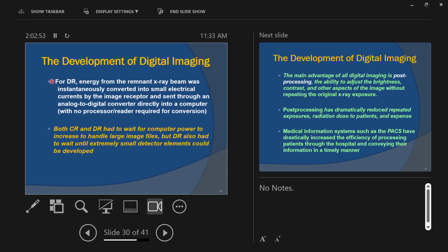That primary radiation, that X-ray beam comes out and then has to pass through something, an object, right? So we have an object that the beam passes through. Underneath the object is an image receptor, or IR, okay? Now, this X-ray beam, it's going to interact with the patient's body, okay? Some of the interactions are going to create scattered X-rays that go in all random directions. Even some of them go back this way, over here, right?